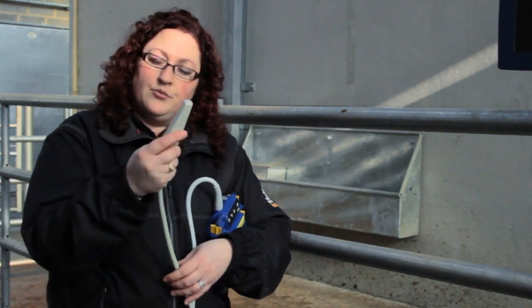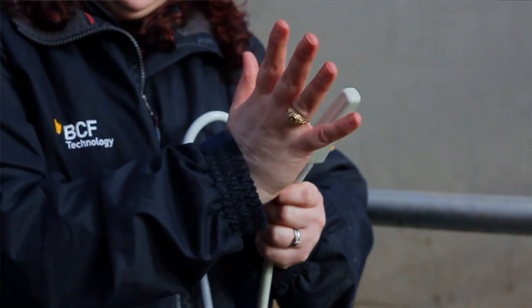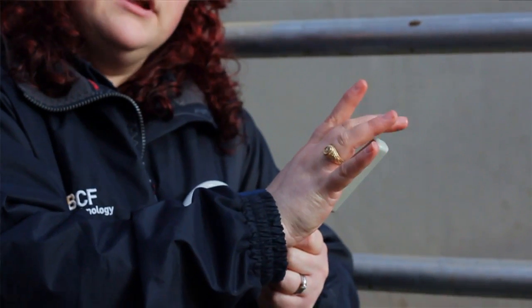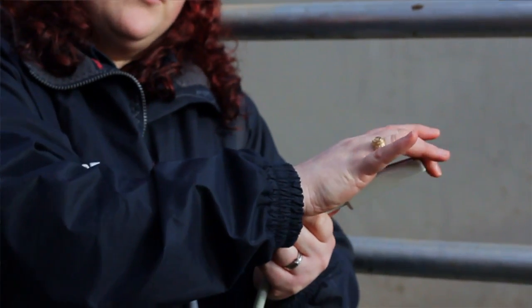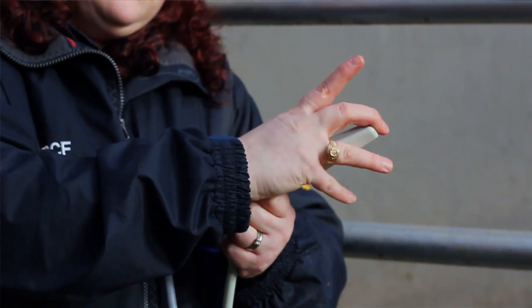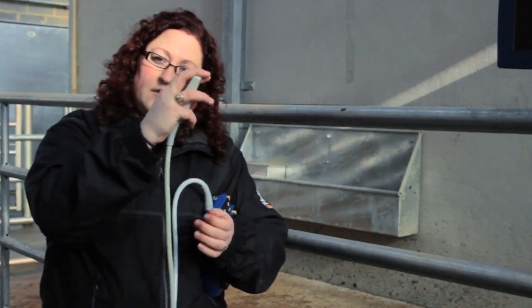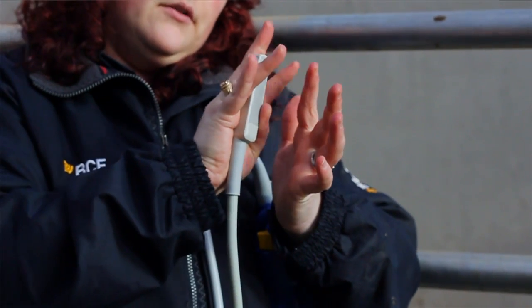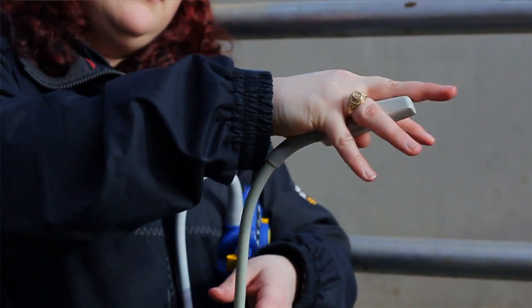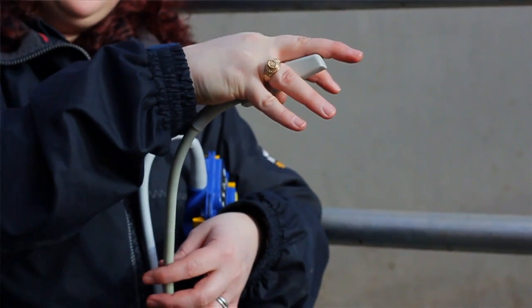The way that you hold the ultrasound probe will enable you to get better or worse pictures. Hold the probe cupped within the palm of your hand and keep one finger near the very tip of the probe, which correlates to the left-hand side of the screen. Grasp the remainder of the probe in your hand, and with the two fingers free on either side — and potentially your pinky as well — you can feel the structures around the probe, such as the uterus.